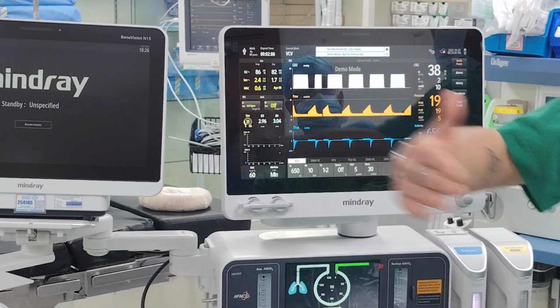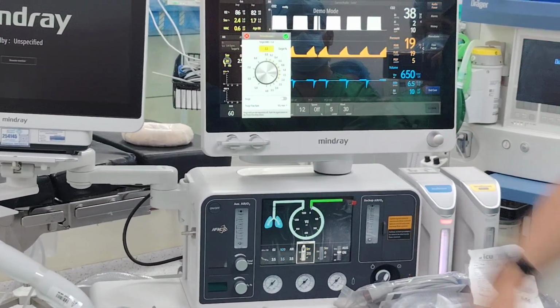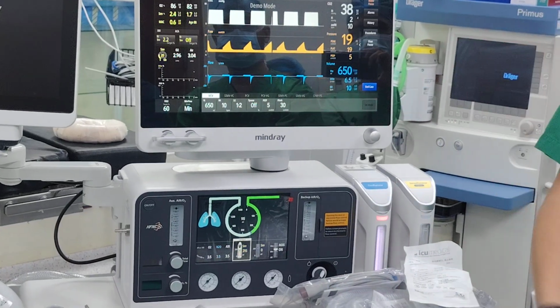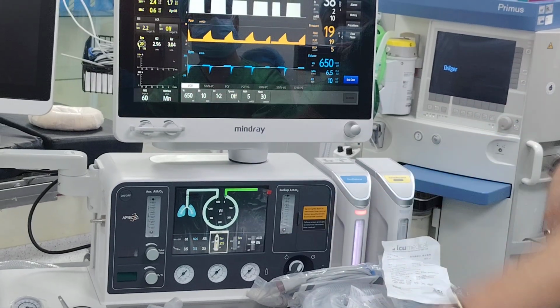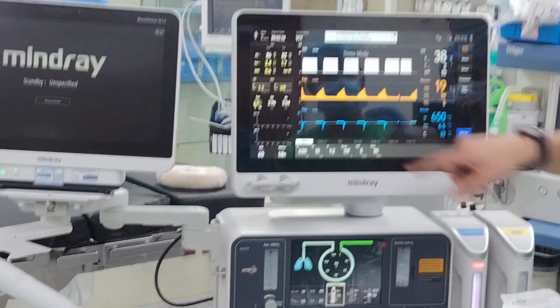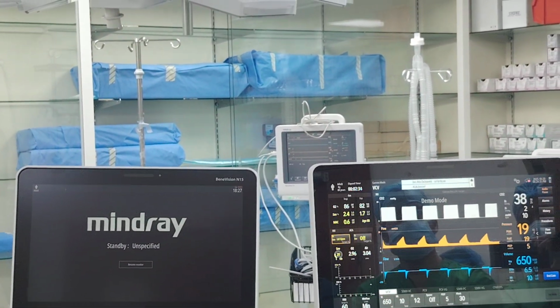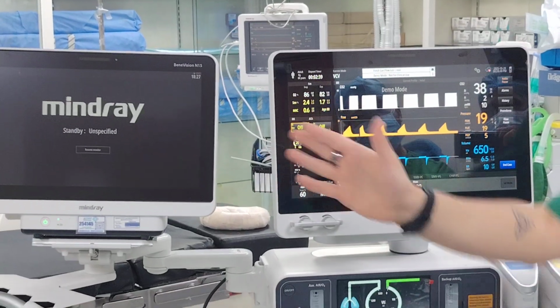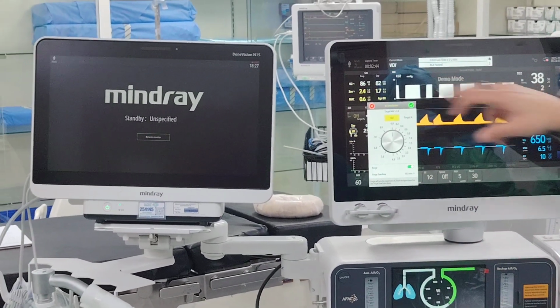Very simple. This is throughout your maintenance phase. When you want to wake up the patient, 2 ways. Either you click the Sevo, put purge, khalas, completely close. That's one technique, which is the fastest one. What if you want to make it slowly? Some doctors like to say, you know what, I keep low flow, but I turn off the Sevo. Here you cannot control the flow, right? No problem. Click this, turn this off. When you turn this off, no more Sevo, because no more target, but it will stay in low flow. Meaning here you have 10 to 15 minutes, for example. But if you want to rush it, then khalas, you click here, go purge, purge it.